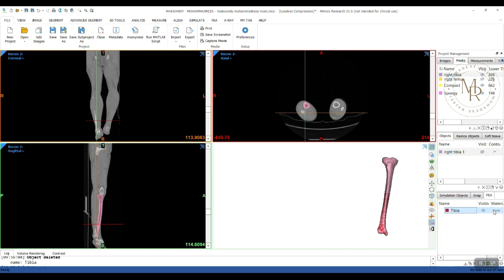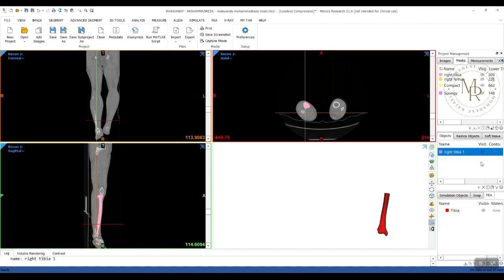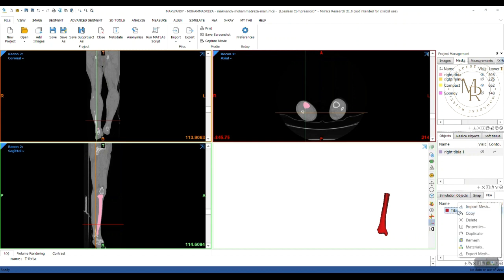As you can see, the material has not been assigned yet. By clicking on the eye icon here, you can change the visibility of the object. I want to assign material for tibia. So, I right-click on tibia, select materials.